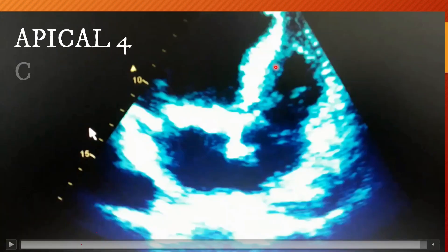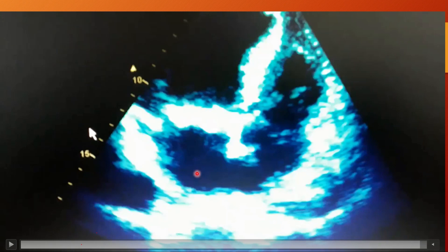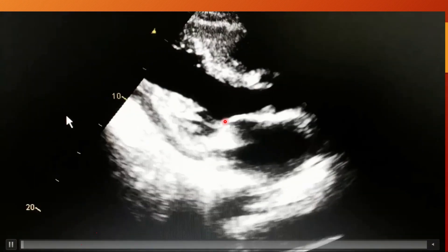Here we have an apical four chamber view where you can see the left ventricle, left atrium, and mitral valve between these two, along with the right ventricle, right atrium, and tricuspid valve between the right ventricle and right atrium.